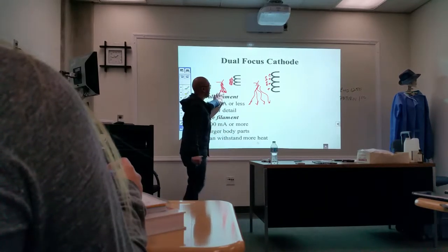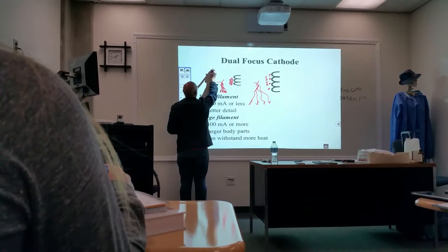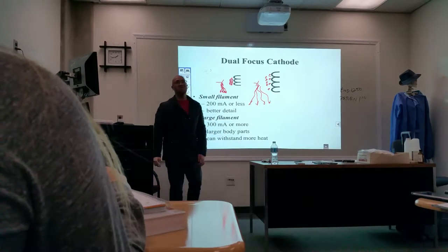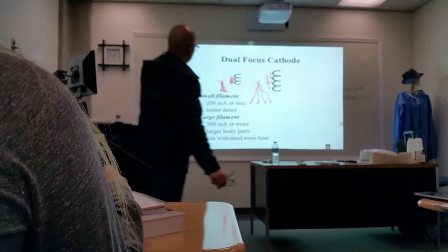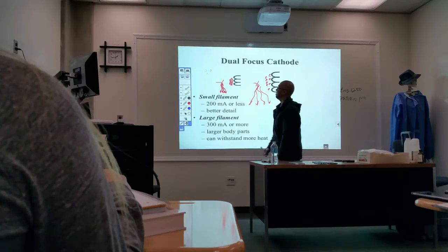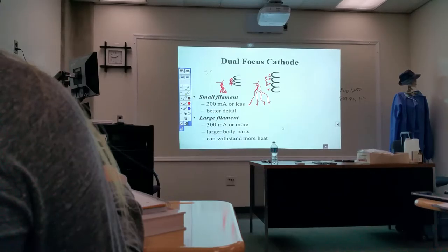So if the X-rays are tightly bound together, you're going to get an image on this side where it looks like something. Can you guys make out what that is? Right? You can make it out, right? It's a happy face. Now, if I take the same number of X-rays, but they're spread out, can you make sense of that? Not as much. It's not as defined, okay? So if they're tightly together, you can get a better image.